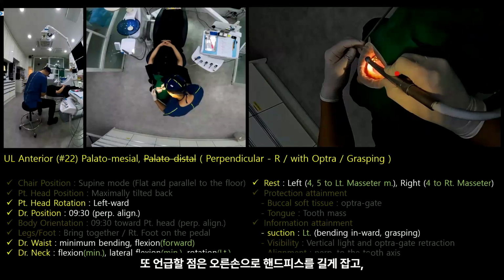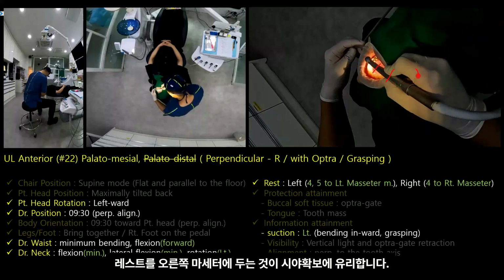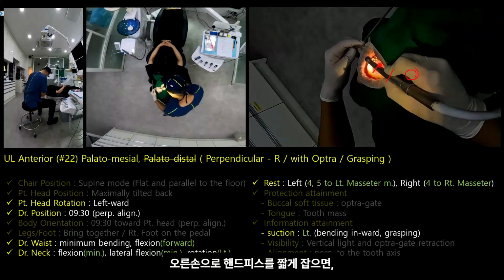Another point to mention is that for improved visibility, it's beneficial to hold the handpiece long with your right hand rather than short and to place the rest on the right masseter. If you hold the handpiece short with your right hand, the rest would be positioned on the premolars in the number 10 area, thereby obstructing the clear view of the target region.